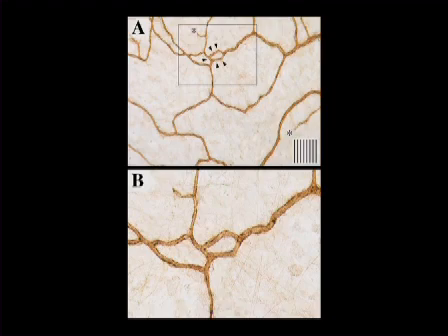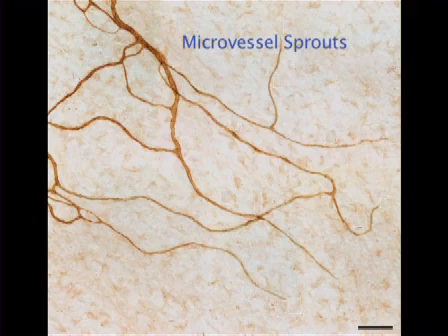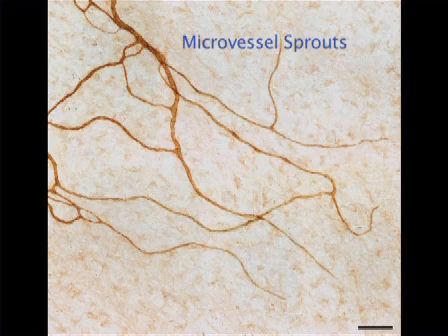The subcutaneous site is popular for angiogenesis studies. However, due to endothelial cell heterogeneity and tissue-specific properties, control of angiogenesis in subcutaneous tissues and subcutaneously growing tumors may not predict control of angiogenesis in metastatic visceral organs such as lung, liver, bone, and brain. This is noteworthy as visceral metastases are usually ultimately responsible for cancer's lethality. The fact that the mesenteric window is visceral should be advantageous in this regard.